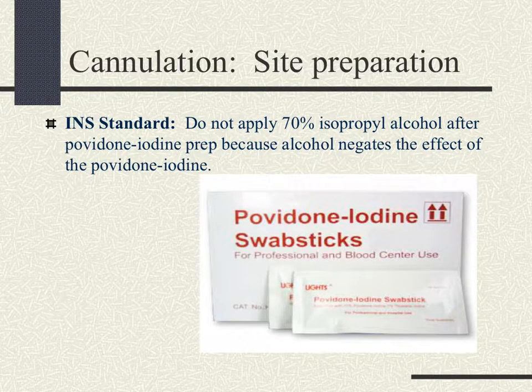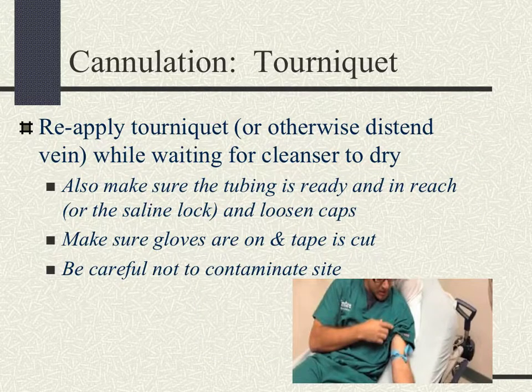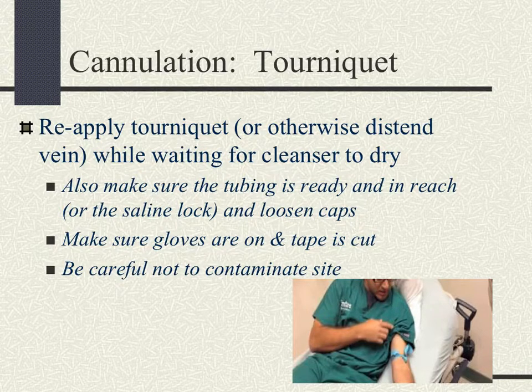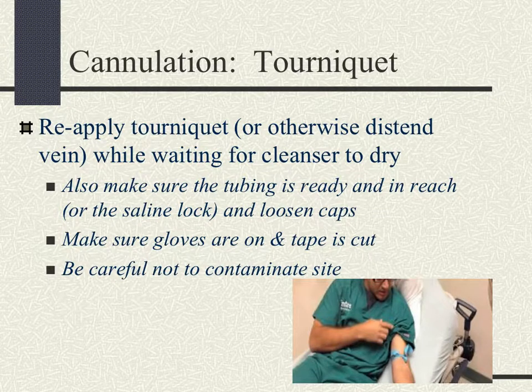Prior to applying the tourniquet, this is the last opportunity to apply your gloves and cut your tape. Reapply the tourniquet or distend the vein while waiting for the cleanser to dry. Make sure the tubing is ready and in reach, or the saline lock is ready to go with loose caps. Make sure gloves are on and tape is cut. Be careful not to contaminate the site you've already cleaned.